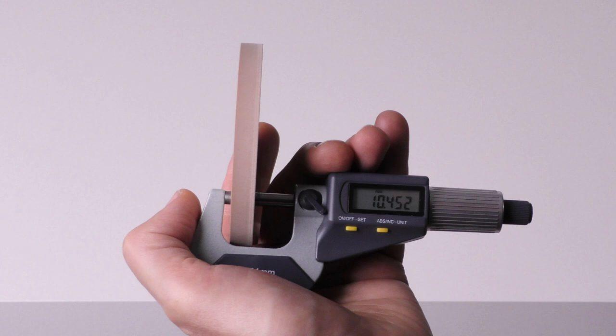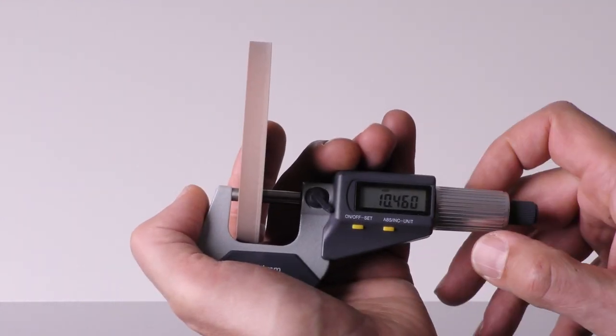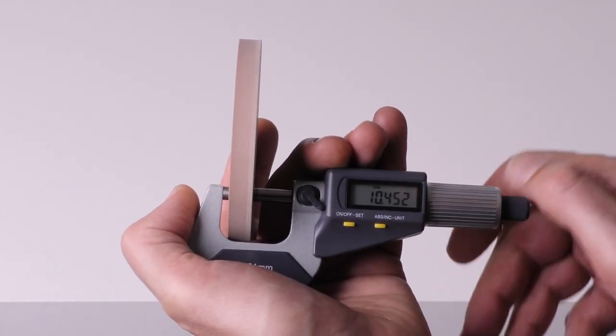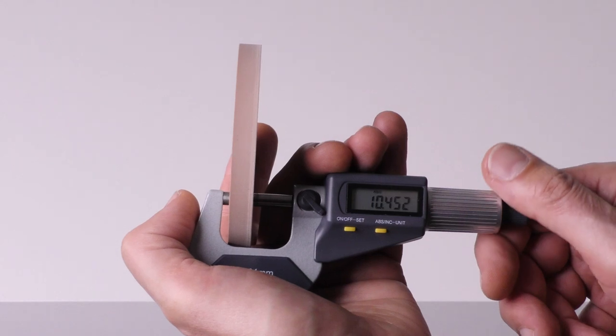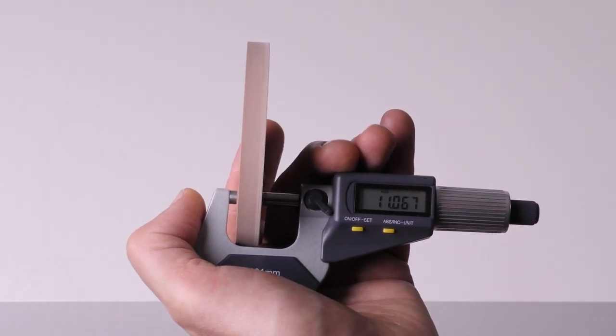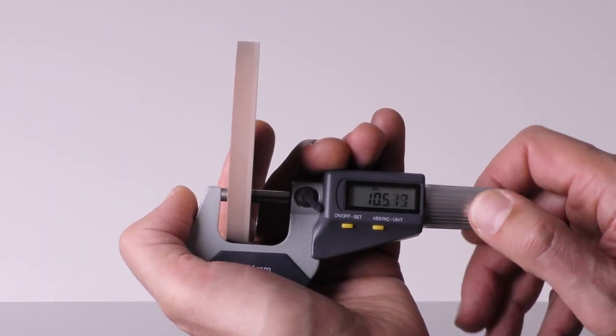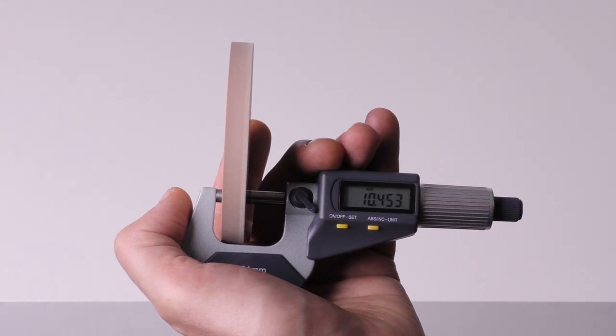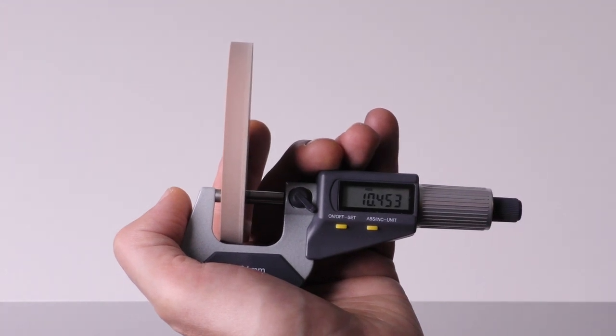If you continue to turn the ratchet, the distance value on the display shouldn't change. Notice: Make sure that the measuring surface lies flat on the specimen and not slanted. Measure each point at least twice to make sure that the measured values are correct. It is very important that you always follow these steps when measuring, as incorrect measurement is the greatest source of error when using the micrometer. This leads to incorrect calibration results.